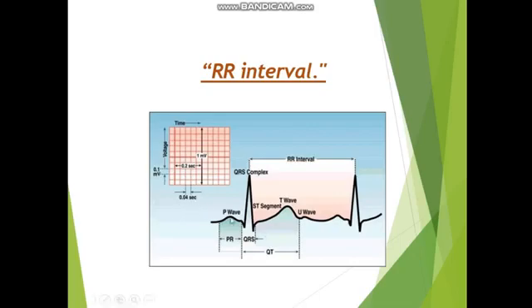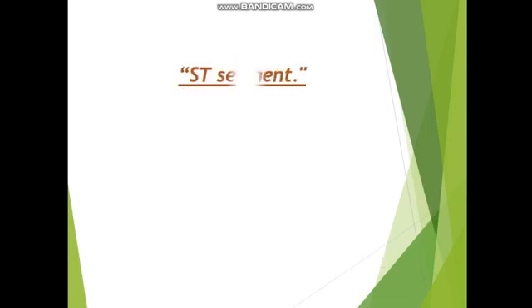Again, for the revision, you're looking here at the PR interval, the QRS complex, the ST segment, the T wave, and the U wave. It's a new feature. The U wave is sometimes present and mostly not present. It is caused by the slow repolarization of the papillary muscle.